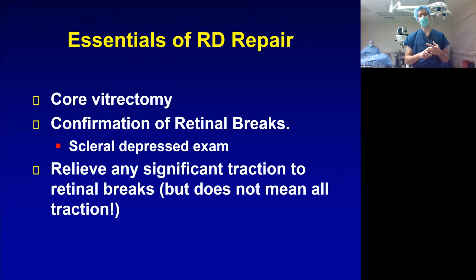You want to relieve any traction to the retinal breaks, but that does not mean you have to relieve all the traction. And we'll talk about that during the case. Quite often the vitreous inserts on the anterior part of the retina, tears the retina open, and it doesn't let go on the posterior surface. So you may not be able to relieve all traction, but you have to relieve enough traction that the retina is no longer being tugged or elevated.